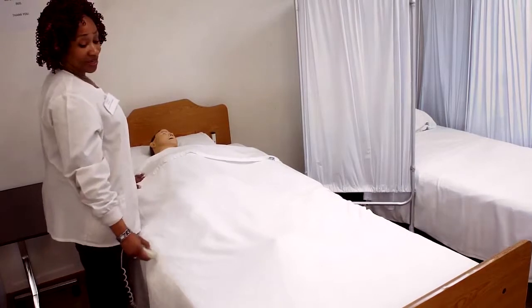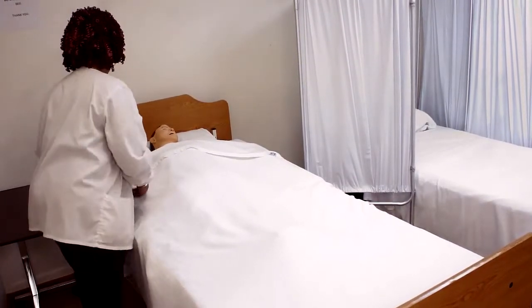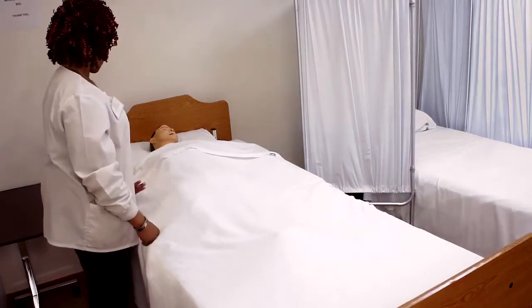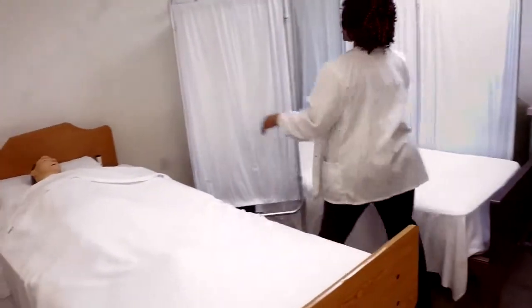Okay, so we always want to bring the bed up to your waist level. Protect your back whenever you're doing any kind of procedure with your patient. I'm going to walk to the other side of your bed and close your privacy curtain, okay? So you always want to give your patient privacy to protect their dignity.